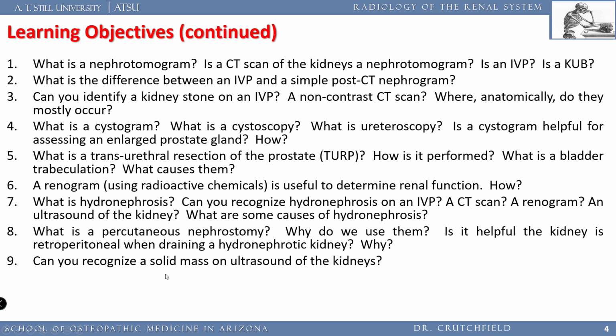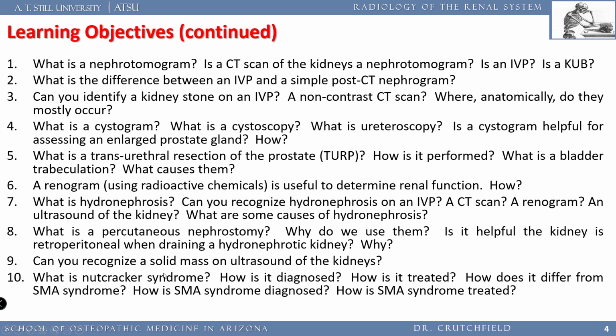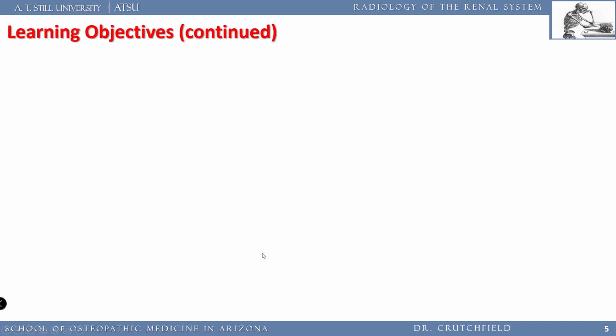Can you recognize a solid mass versus a cystic mass on an ultrasound of the kidneys? What's nutcracker syndrome? How's it diagnosed? How is it treated? And how does nutcracker syndrome differ from SMA syndrome? And how is SMA syndrome diagnosed and how is it treated?